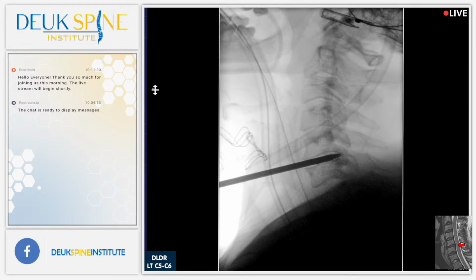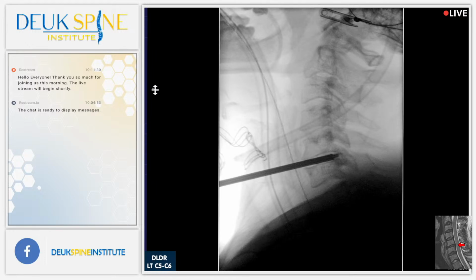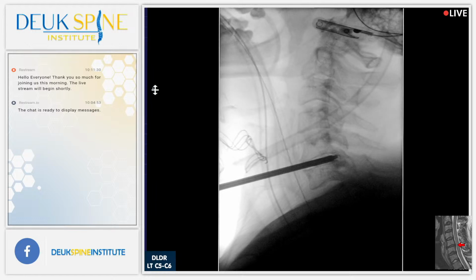Almost done. All right, so we just got a little bit more to go. Just about there. Any questions? No current questions. All right, I think that's it. I don't want to go any further.